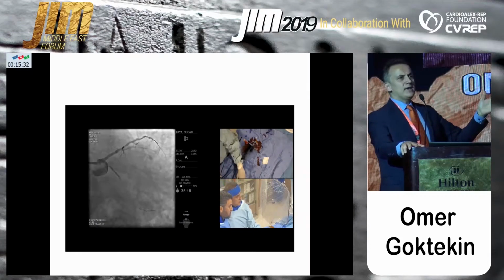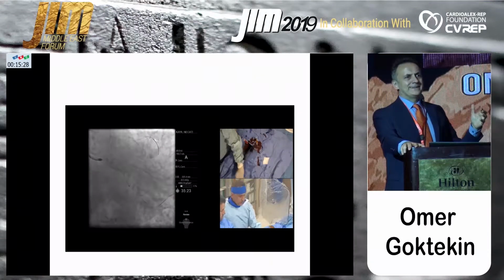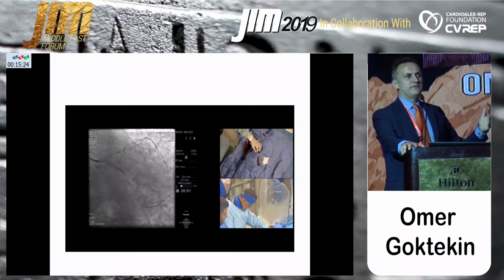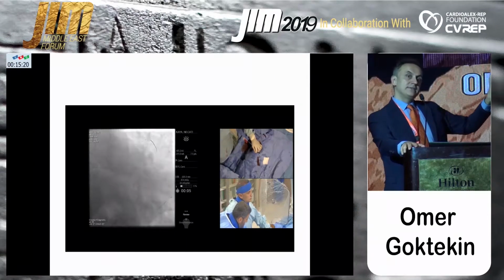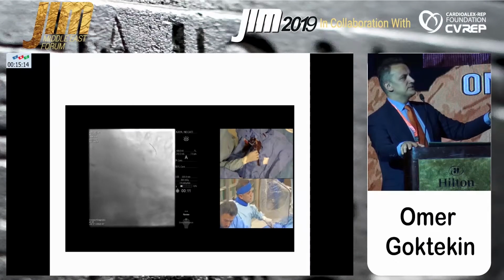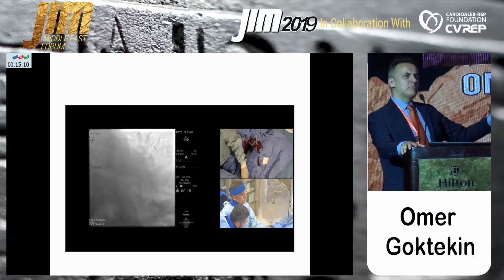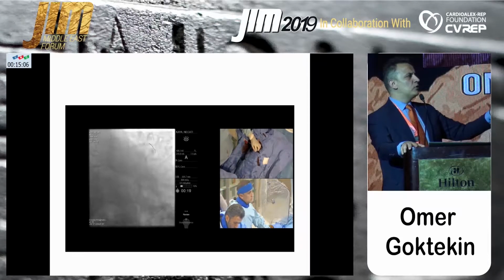But I think in almost 56% of CTO cases like this, you can cross with Pilot 50, Pilot 200, or with XT or a hydrophilic wire. In this kind of CTO I'm talking about. And we are now in the distal. This is Pilot 50. We can change this wire, but I think we can also use this wire. What do you think, Colombo?